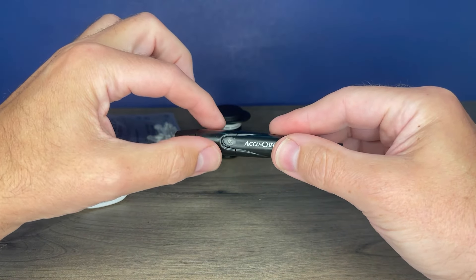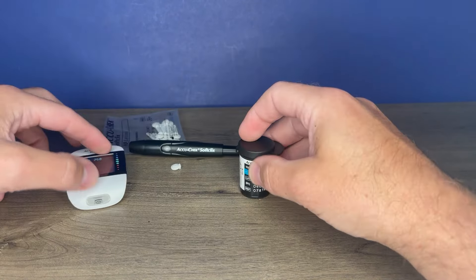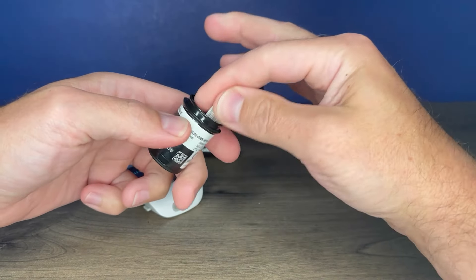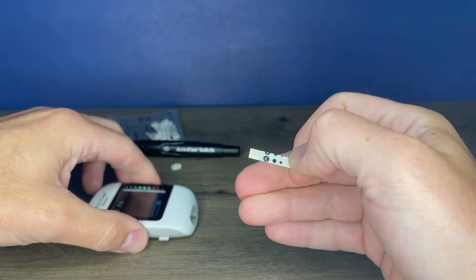To load the lancet device, push the end and the window turns yellow. When the button is pushed, the spring sends the lancet forward and it turns clear again. Next, get a test strip from the vial. Always keep the vial of test strips closed when you're not retrieving a test strip. The silver end is what's inserted into the meter.